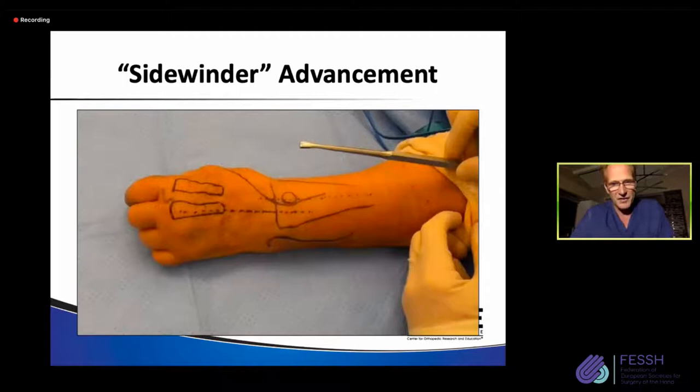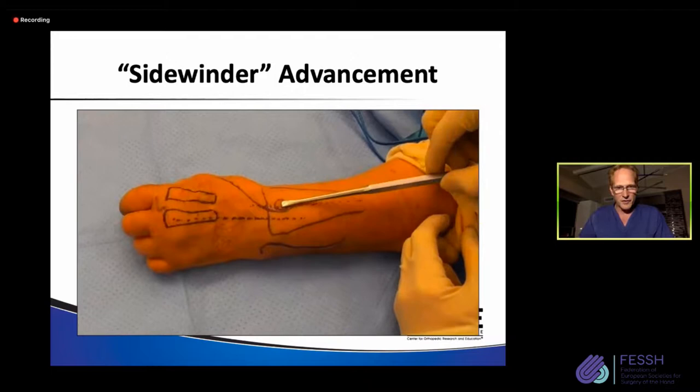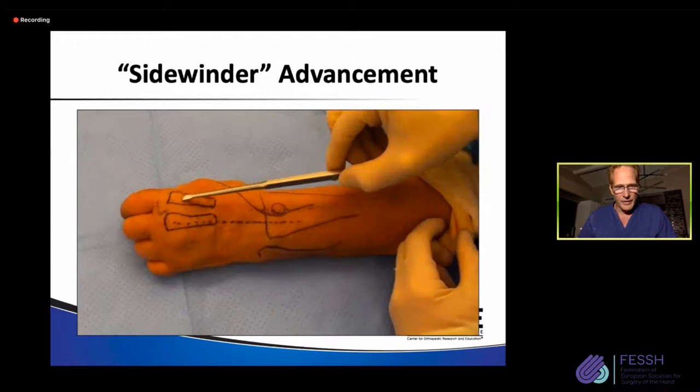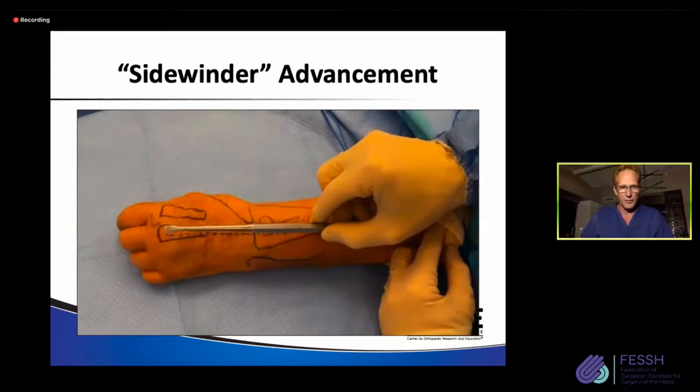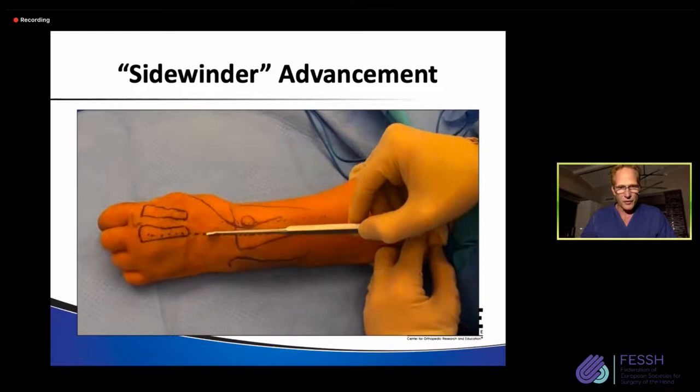I'm gonna try to narrate this as we go. So there's the Lister's tubercle. Here's EPL running around here. Here is the third metacarpal, the second metacarpal. And the plates of yesteryear just jumped over Lister's tubercle as it made its way; this one passes to the second metacarpal very easily. However, the third metacarpal doesn't align very well. And as it runs, here's the fourth dorsal compartment running from the third metacarpal, but then it falls off the radius.